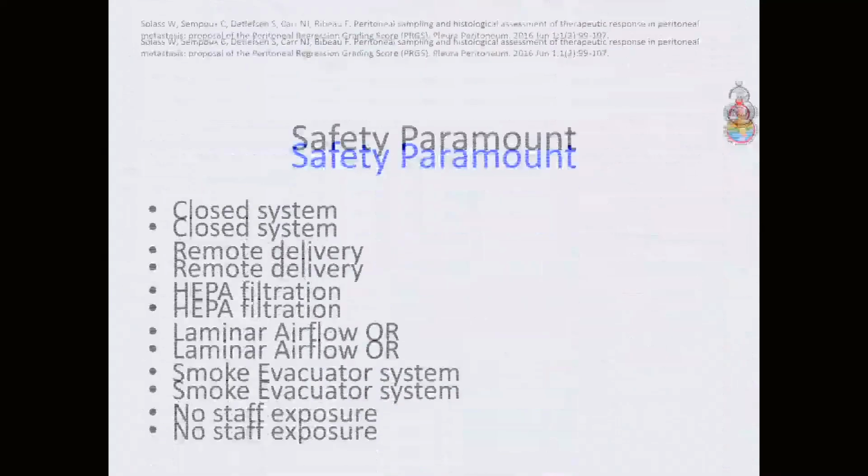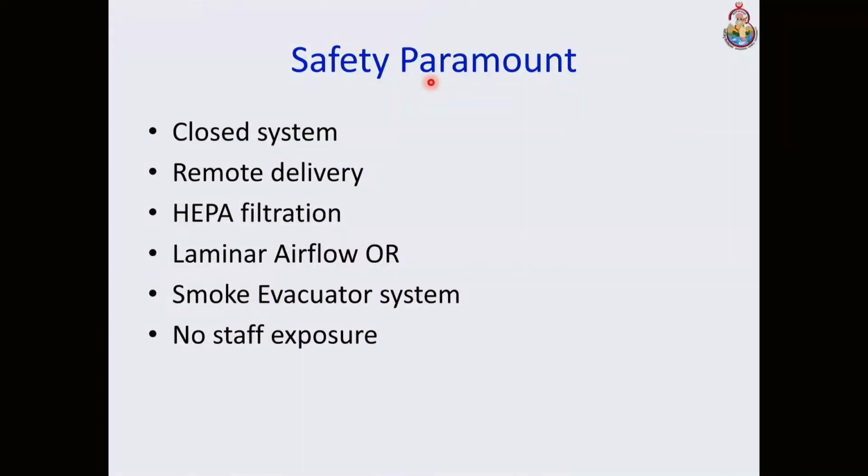responded. Safety remains paramount. Although this procedure looks very safe overall, you have to be very careful while using it. It's a closed system. There should not be any contamination of the OT. The OT should preferably have laminar airflow and HEPA filtration, or if you don't have that, you have to have a smoke evacuator system so that the exposure to the staff is negligible. Although there have been many studies showing that even otherwise, exposure in the OT atmosphere is minimal, negligible.